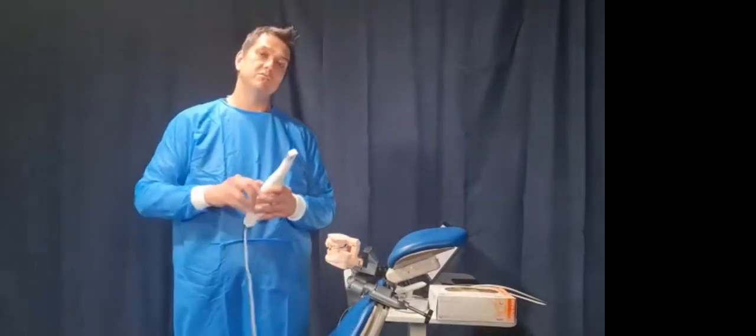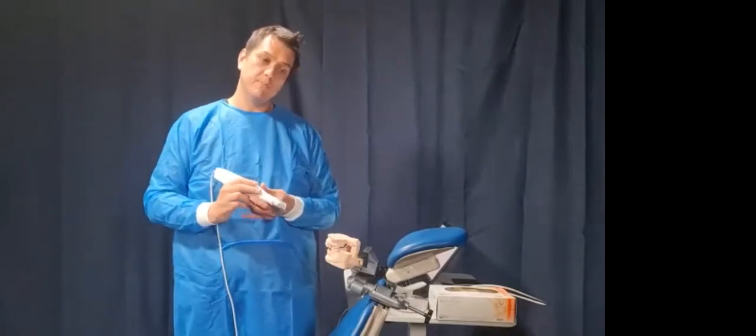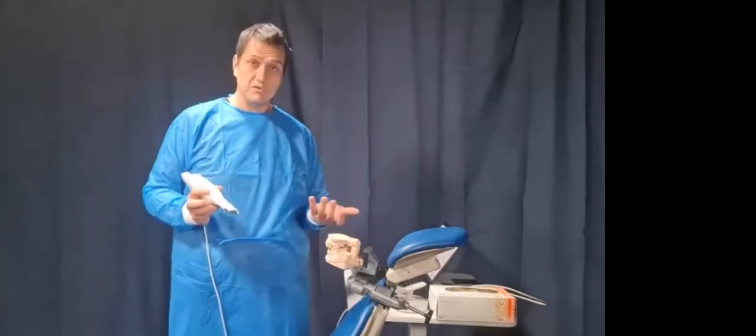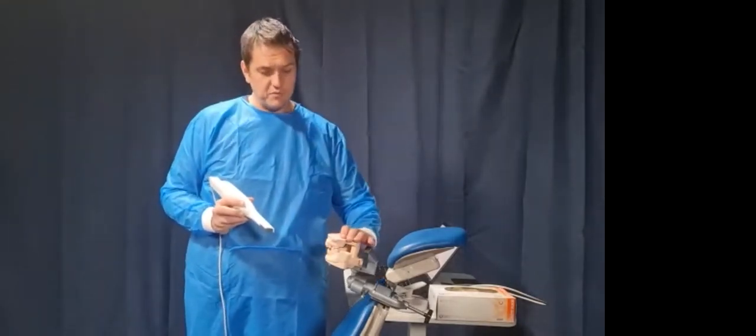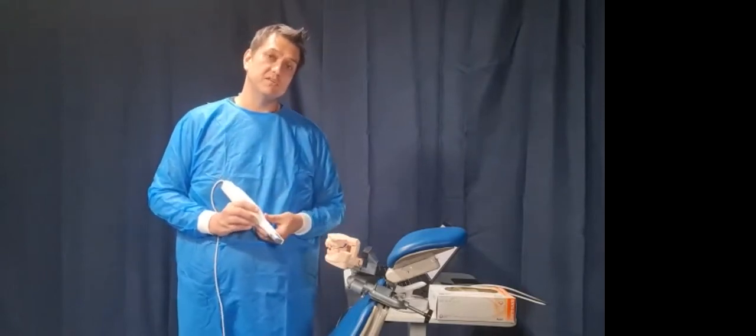I would then ask my patient to open, pop my scanner in, and get it down the back, exactly what I'm going to do now. So we'll do this occlusal record. I also have to premise this: 3D printed models don't have saliva, they don't have moving mucosa, so recording a bite on this is a lot easier than the real thing, than when I really did this case. So if it scans and occludes very quickly, I'll keep going and show you the path that I actually did to record this case. I will get my cameraman again to pop in and ruin our beautiful image as we do this case.